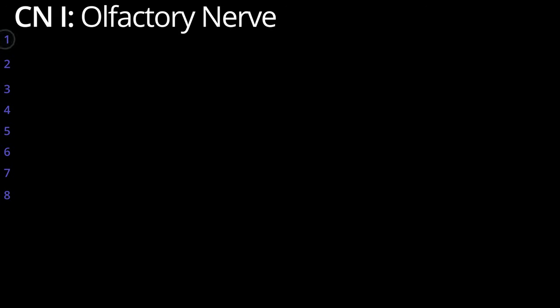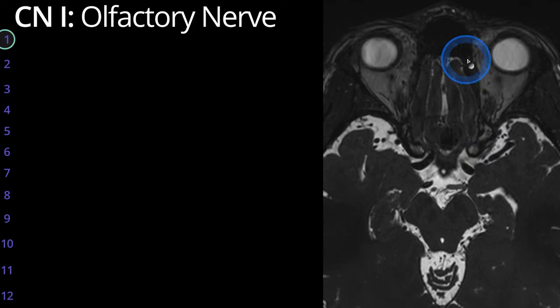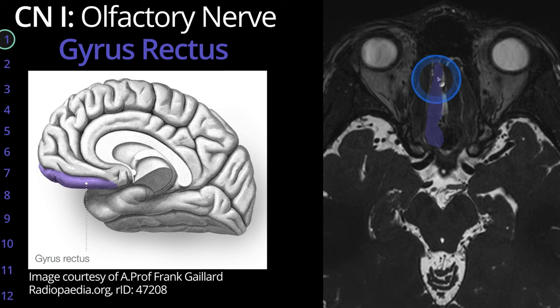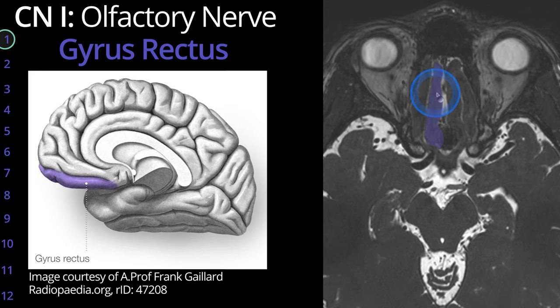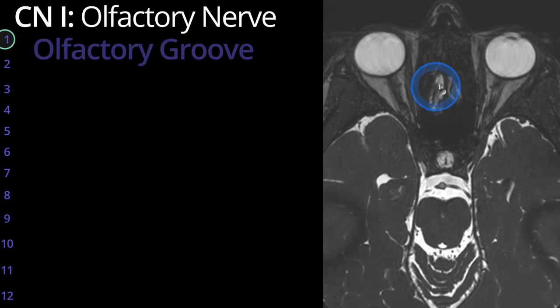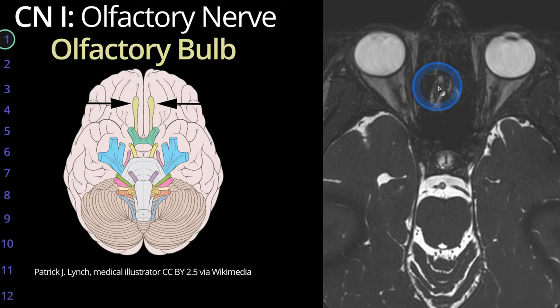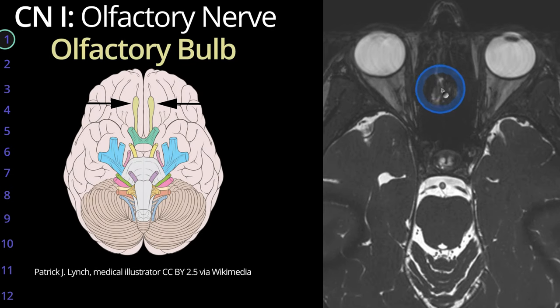We'll start with cranial nerve 1. To see cranial nerve 1, we're going to look into the anterior cranial fossa. Along the anterior medial frontal lobe is what is known as the gyrus rectus. Immediately inferior to that, you have the olfactory groove, and in this olfactory groove lives cranial nerve number 1, the olfactory nerve. Here is the olfactory bulb.